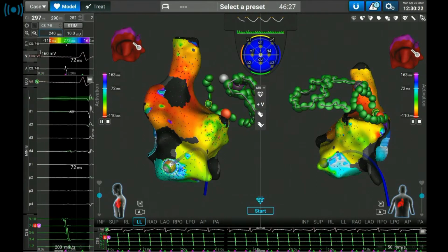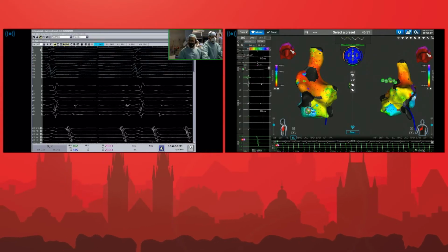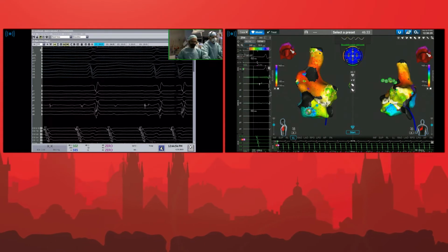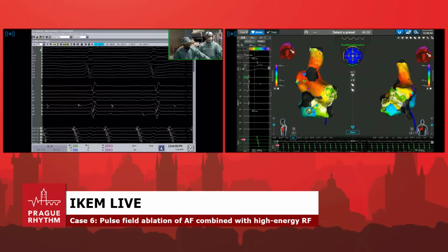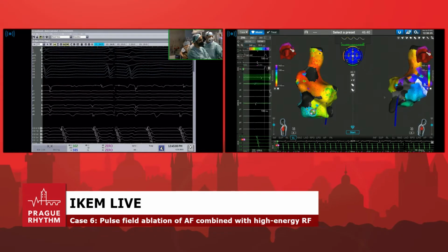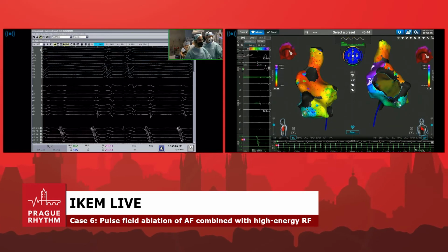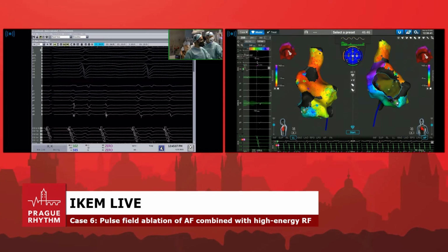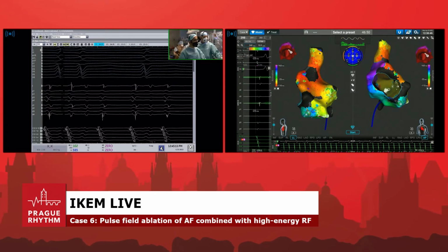it. Any questions, Joseph, before we move on about what we have done so far? I think it's very instructive again, so everybody can follow what's going on. You see, again, isolation of the whole posterior wall, all pulmonary veins, then typical flutter with clockwise rotation.